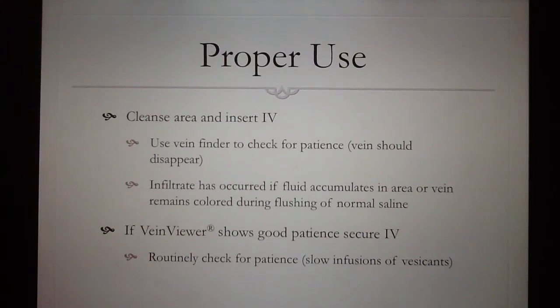Prior to entering the patient's room, ensure that you gathered all of your supplies, performed good hand washing technique, and donned clean gloves.